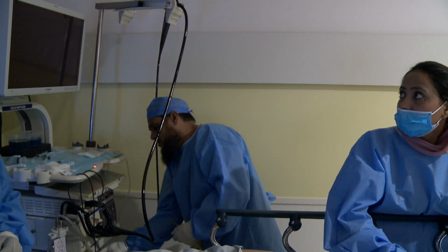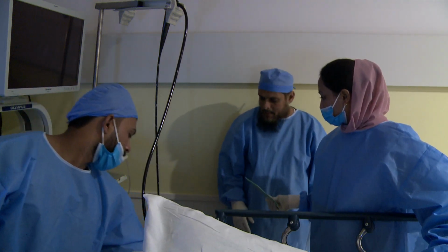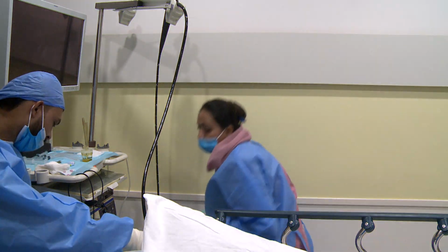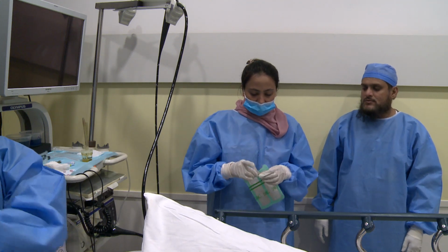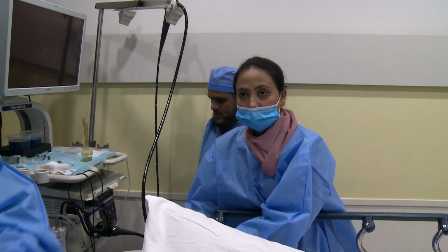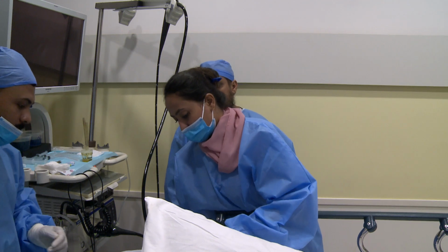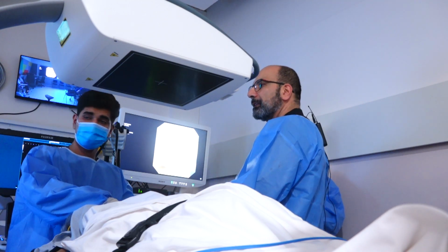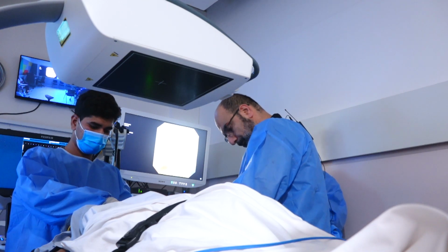Mustafa, we are with you. Okay, can you see our images? I don't think you can. We can't see your images yet. If they could show you the fluoro image, that'd be good. There was a concern about ascites in this patient. Was that an issue? We're going to find out. I've gone ahead with the assumption of doing an EUS-GJ. But once I put the EUS scope down, I'll let you know. Please show the fluoro from our room. You need to see the fluoro right now. Please put the fluoro on.